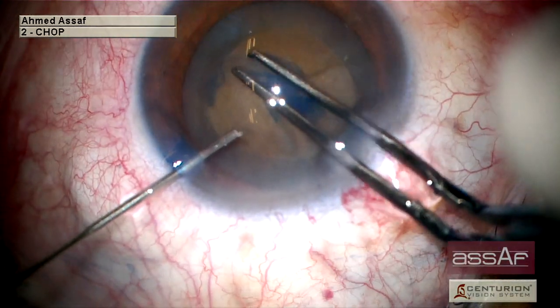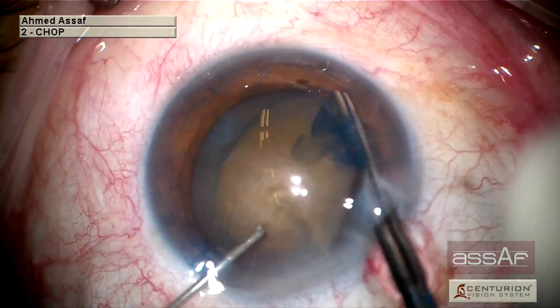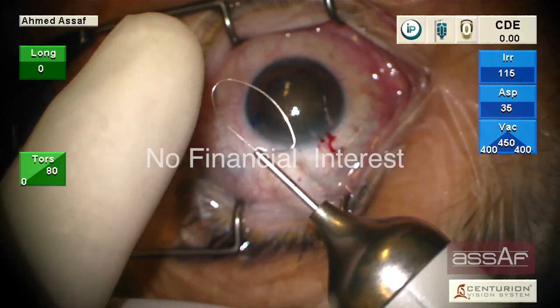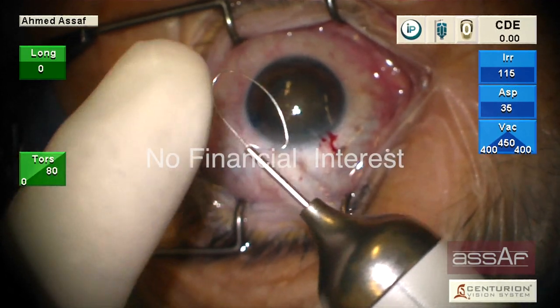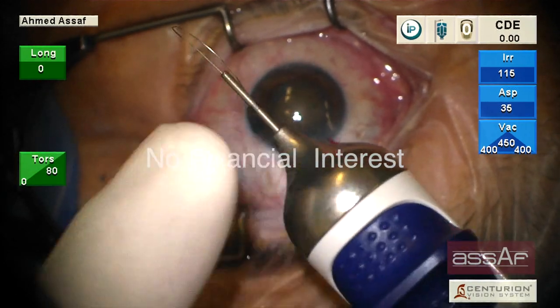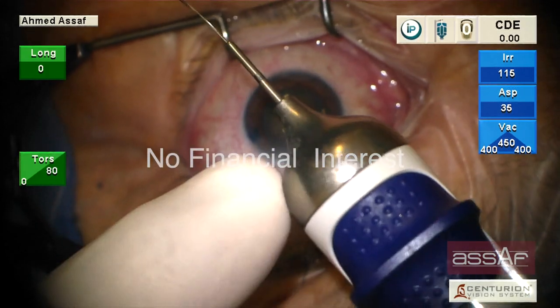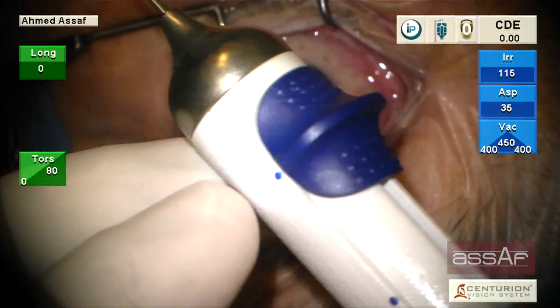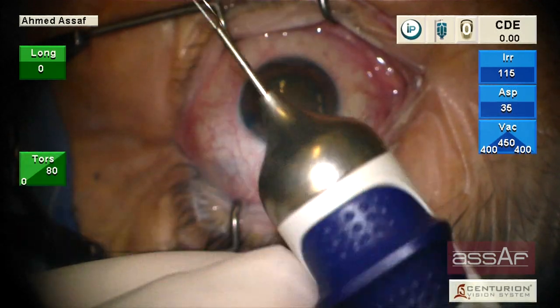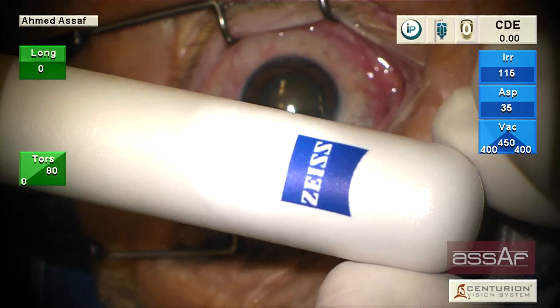If the femtosecond laser is not available for any reason, we can use the miLOOP. It is a disposable handheld device with a shape-memory expandable nitinol loop to snare and cut through the nucleus into two halves. The nitinol alloy is very soft and hence very gentle on the lens capsule. This device is provided with a lever to advance and retract the loop inside the eye. It is made by Zeiss.